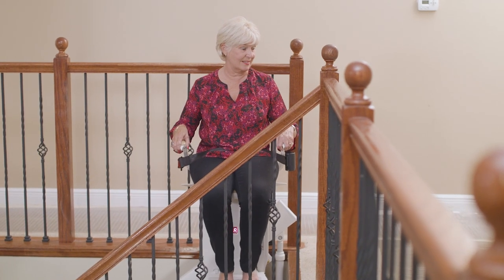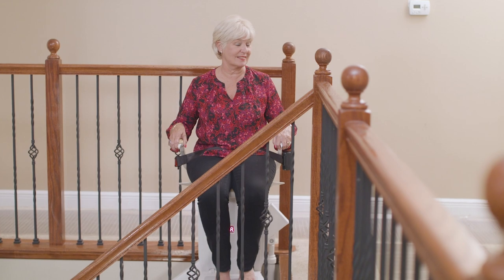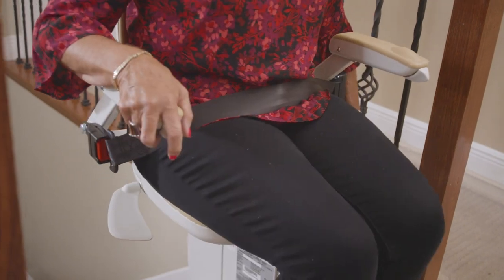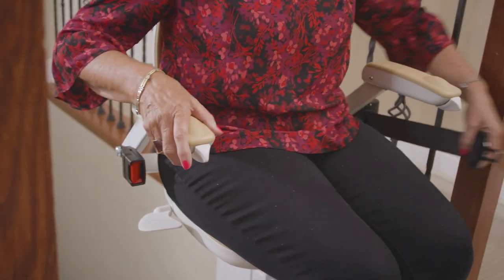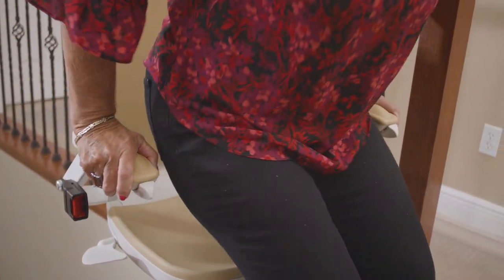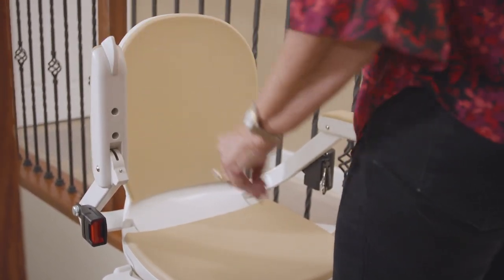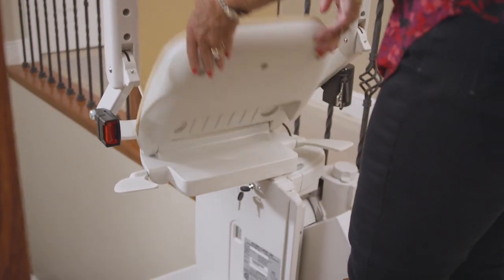The stairlift will automatically slow down and stop when it reaches the end of its travel. To swivel the seat, hold down one of the seat paddles and rotate the seat. Release the paddle and keep rotating until it locks into position partly or fully around. It is now safe to undo the seat belt and leave the stairlift. You may at this point swivel the seat back into its locked position and fold the footrest, arms, and seat up.